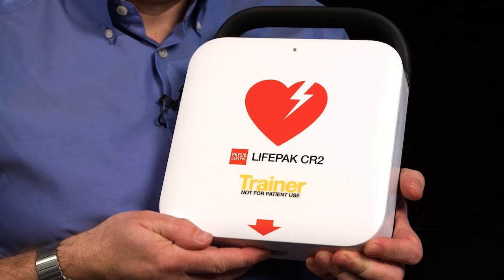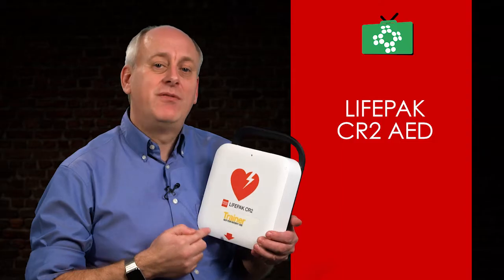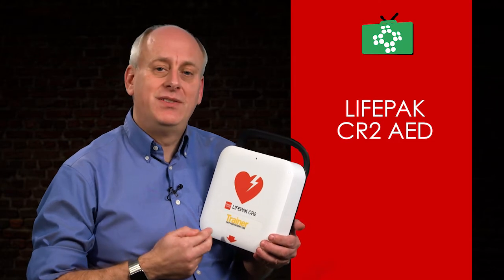The CR2 is the only AED that allows chest compressions during the ECG rhythm analysis, thereby reducing pauses between CPR and defibrillation.